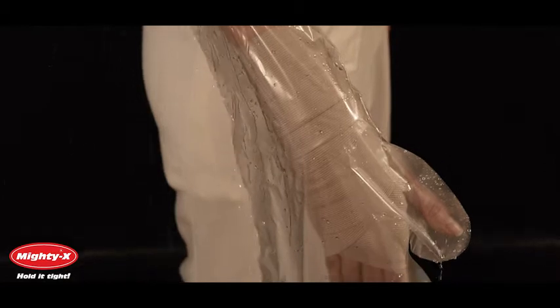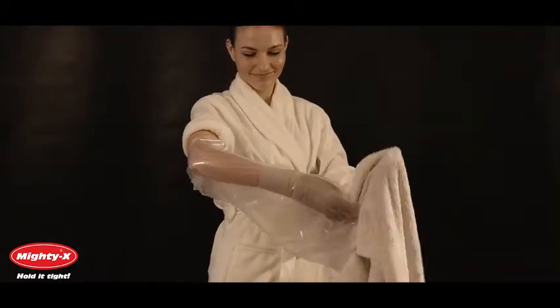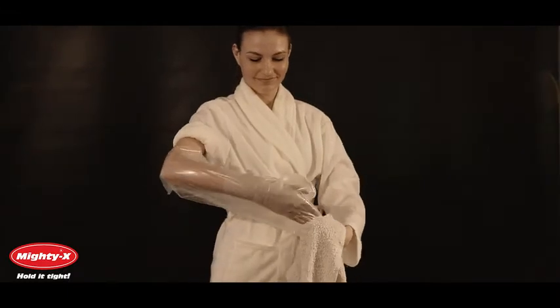In order to get multiple uses out of your arm cast cover, dry it completely with a bath towel and gently pull it off over the cast. Once removed, lay it flat in a warm, dry place.